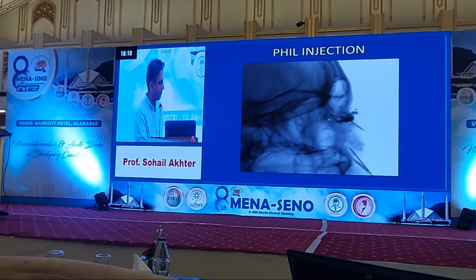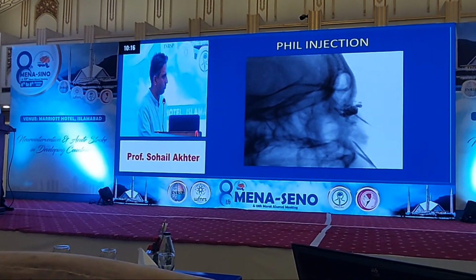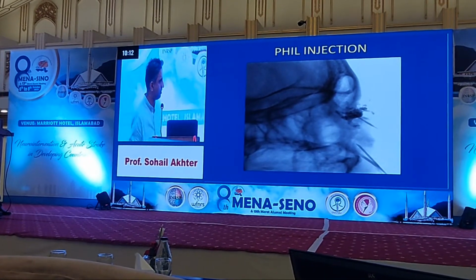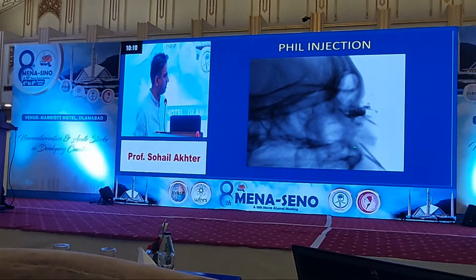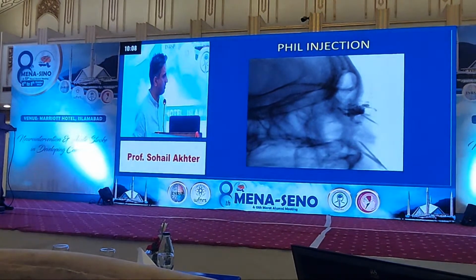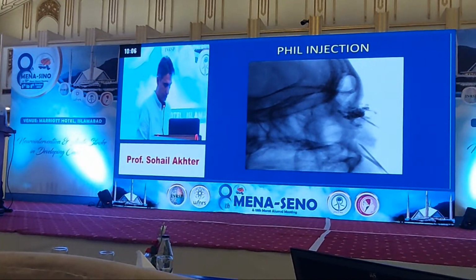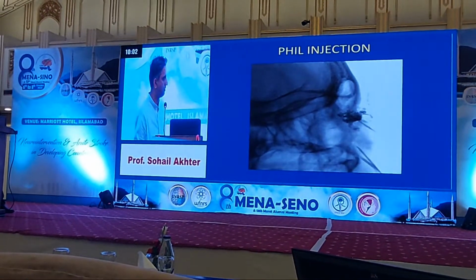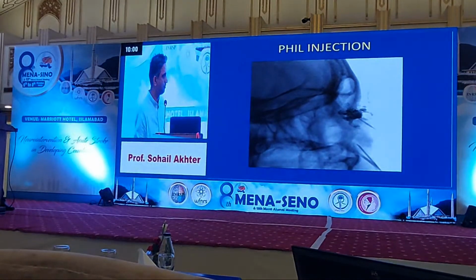Now the back part of the nidus as well as the lower part. Again the back part of the nidus and the superior aspect of the nidus.